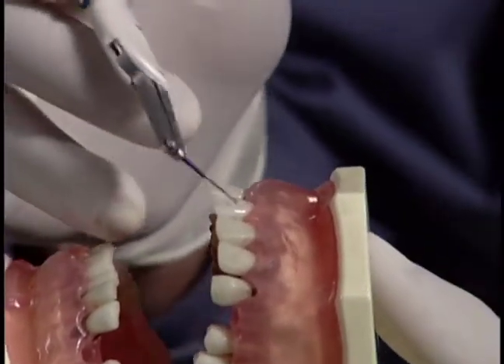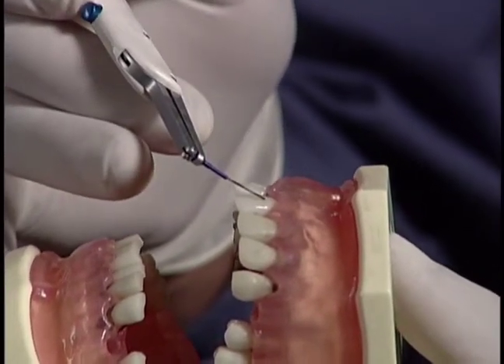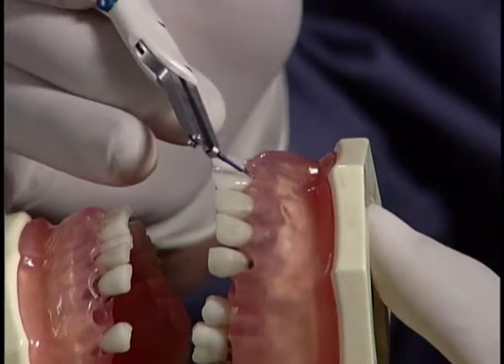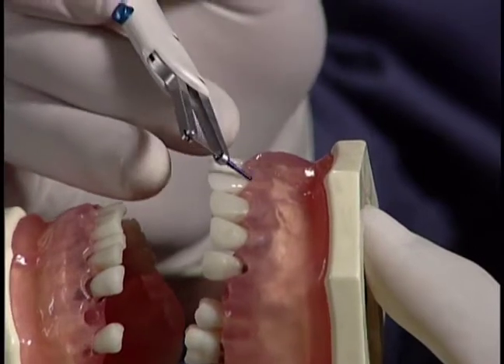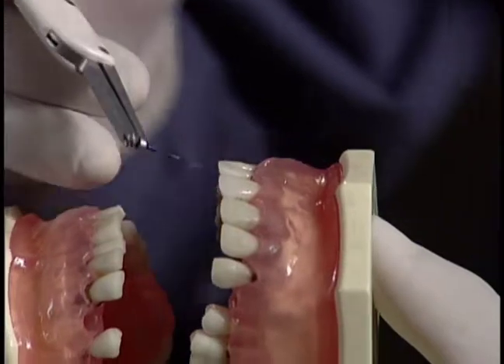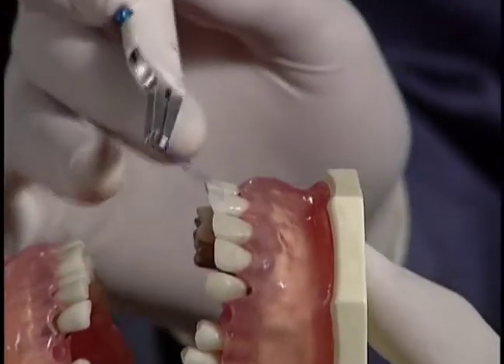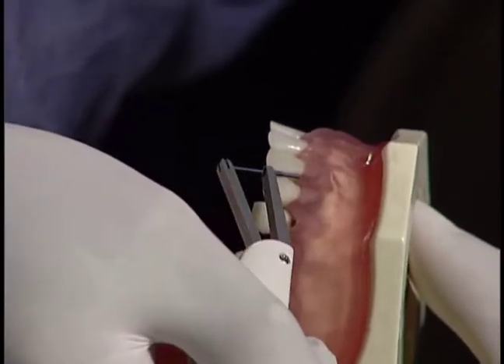I need to increase my angulation, start slightly coronal to the gingival margin, and let it slide into the periodontal pocket by sliding down the root surface. The same thing is true interproximally. I need to make sure that I'm following the long axis of the tooth going toward the apex and increase my angulation. A helpful technique may be to turn your hand over and approach it from a different angle.